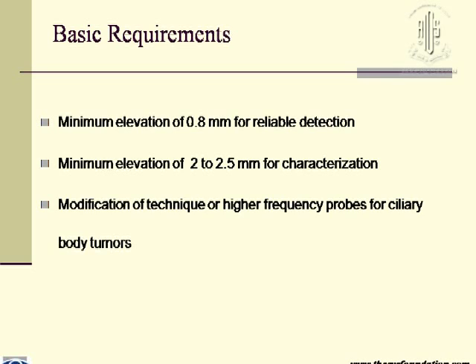For example, if we are dealing with ciliary body tumors, the lesions have to be much larger, and in these situations either one can use the immersion technique or one can use probes with a higher frequency. And another option is to go for UBM.